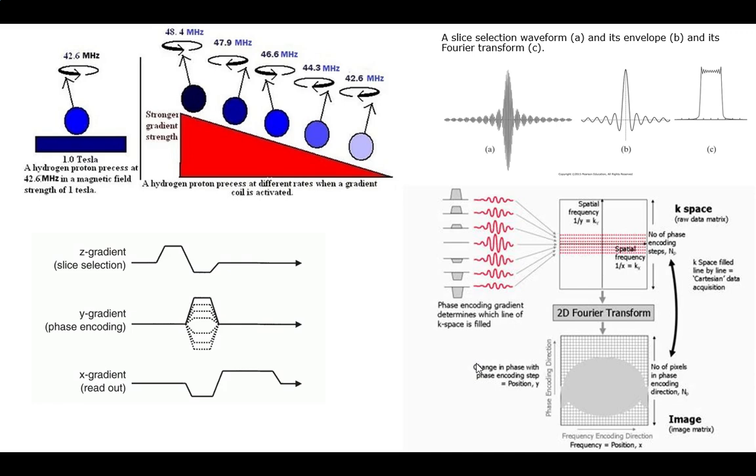I have a question. These XYZ gradients, those are actually physically, spatially graded. That's the gradient coils. Okay. Yeah. So I have a question about that. If we have our 3 dimensions XYZ, and we give a gradient to each one of them, wouldn't that just create a plane of constant frequency? But we don't do it at the same time. This is time. Oh, I see.